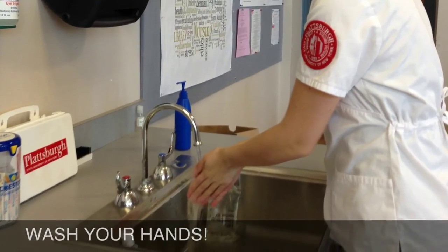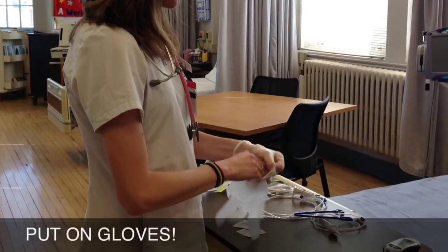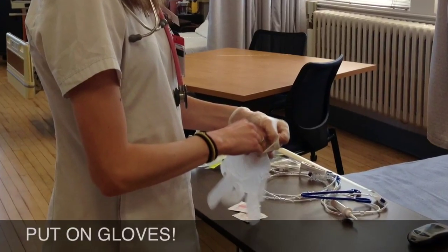Then you're going to scan the ID bracelet. We cannot stress the importance of good hygiene — always wash your hands. It's also really important to wear gloves, because you never know what medications can be absorbed through the skin.